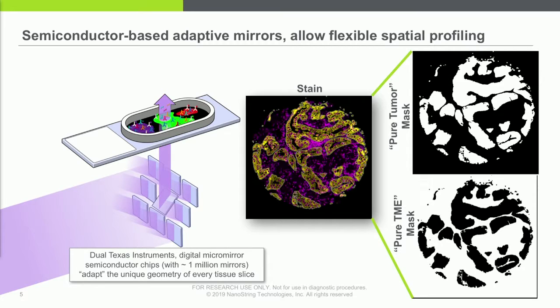I take a picture of that, and I can dope in the fluorescent color markers, but they can be doped in a very unique manner. So this is pan-cytokeratin you're looking at. The yellow signal will light up all the tumor-specific cells. Now I wanted to be able to profile automatically just those tumor-specific cells in a pure manner.